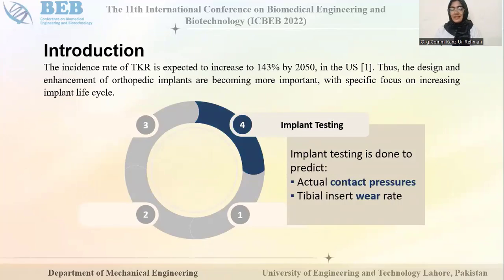In the computational design stage, primarily what we are looking for is a preliminary design elimination process in which we filter out our designs before they are sent for a more expensive and more time and cost intensive experimental analysis, right?